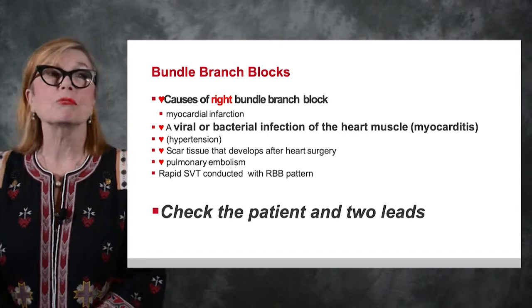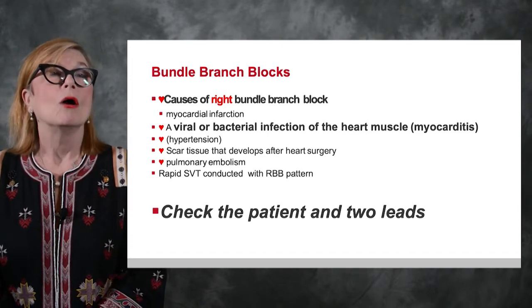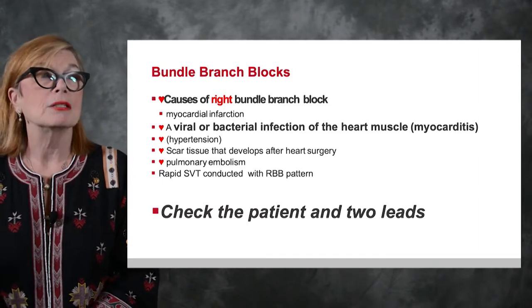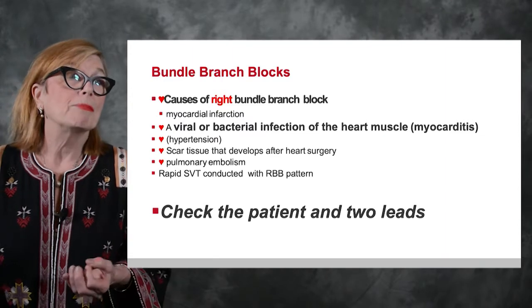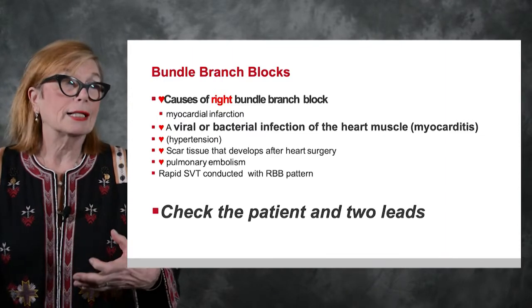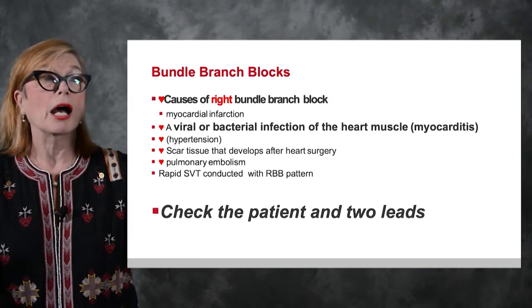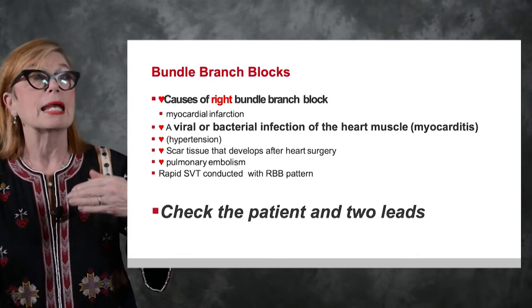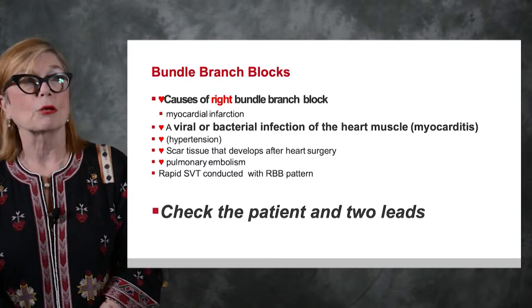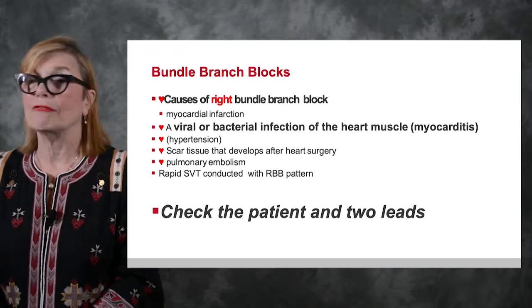So now let's move to right bundle branch block. By the way, right bundle branch block often happens because the right bundle is refractory a longer period of time. Less oxygen delivery to the bundle, so with a high heart rate, you could actually be in a bundle branch block pattern. That's known as rate-related bundle branch block, and it is something we see quite frequently.